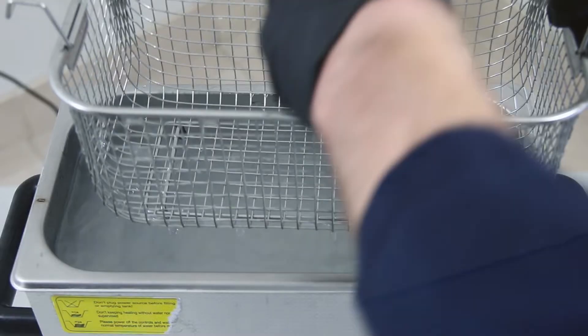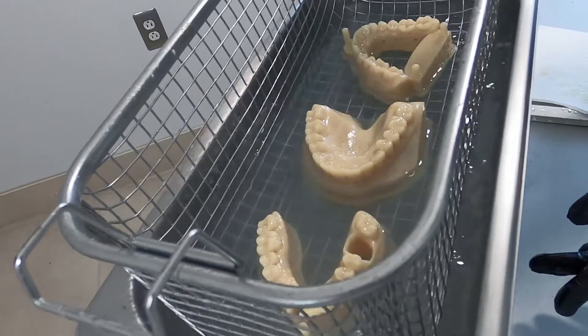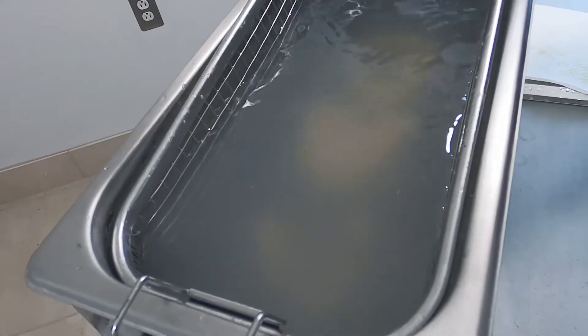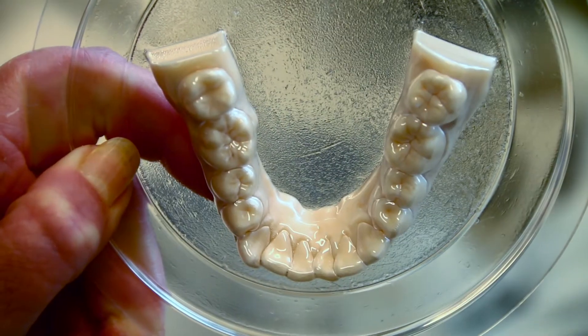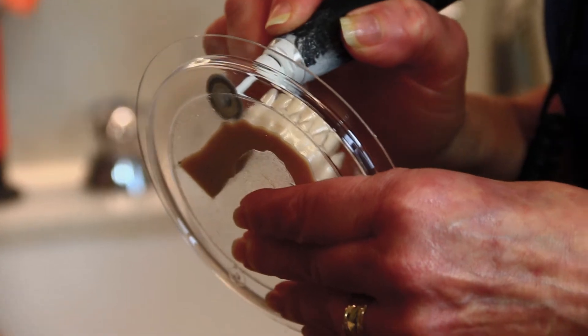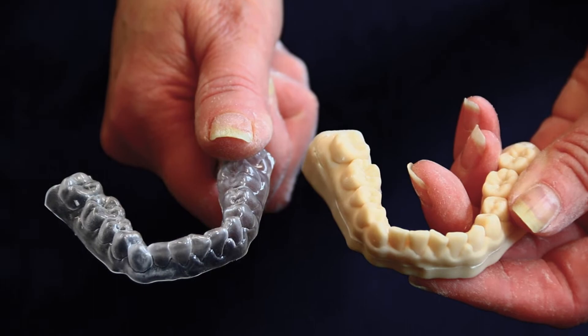The E-AQUO model is a hundred percent water washable resin that could be used in a lot of applications, including models with removable die, ortho models for clear liner suck down. As such, we have been able to reduce the burden and the pressure for our users trying to find alcohol, which is extremely expensive.